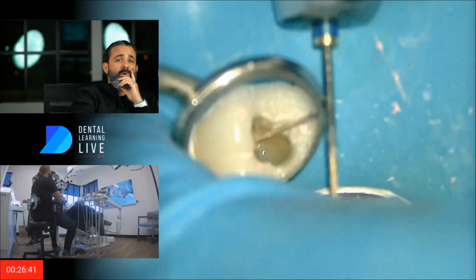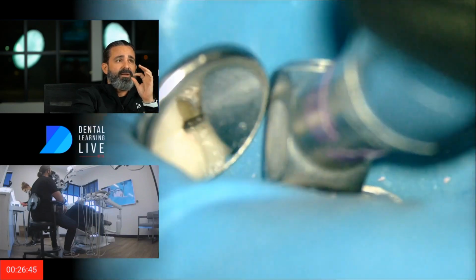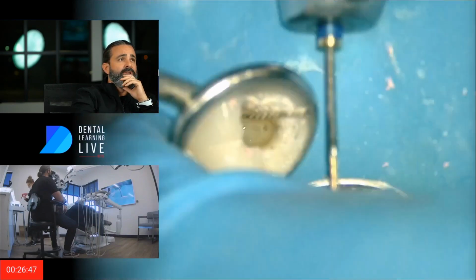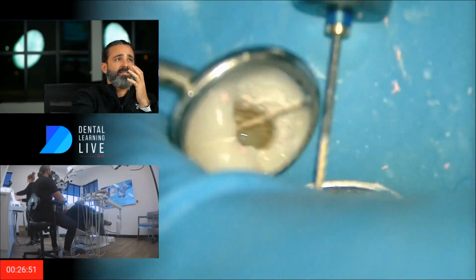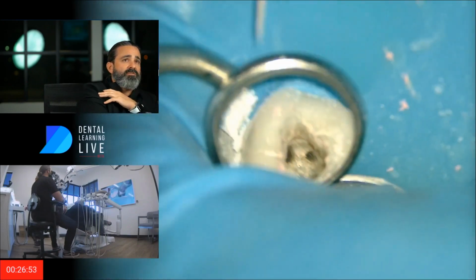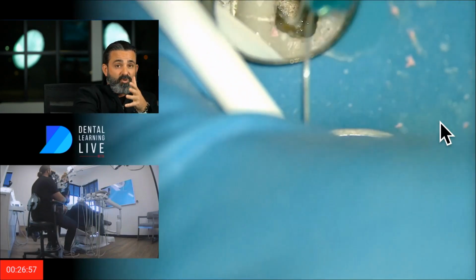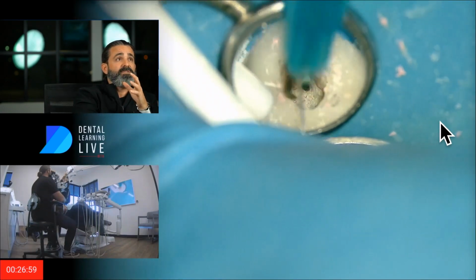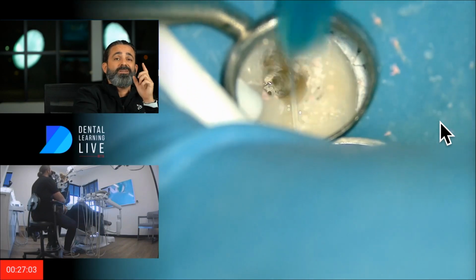And now I'm going up a little bit. Now that I'm not getting that little bite down there, I'm just going up a little bit with the file. I'm not trying to engage the dentin. I just want to make sure passively there's no more gutta percha. And if you look at my file, I just found gutta percha. True to form, trust but verify. I just verified I actually wasn't as clean as I thought, and by so doing, there was gutta percha.